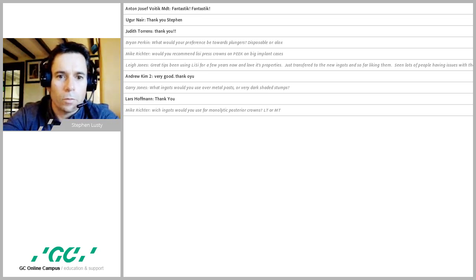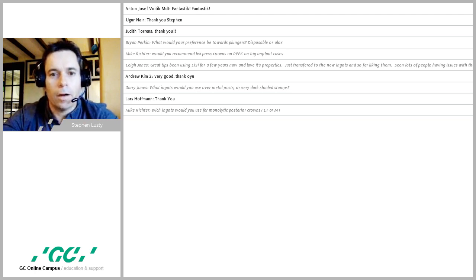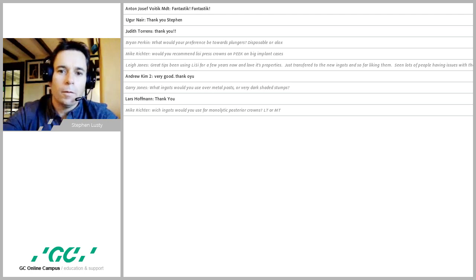So, Brian Perkin asks, what would my preference be towards plungers, disposable or Alox? As I said, Brian, I am using Alox at the moment. I've heard a lot of good things about the disposables, and the recommendation is towards disposables. I suppose when my Alox ones wear out, then I will go on to disposables. But at the moment, I'm finding that if you are really using the separators well with the Alox plungers, you don't have any problems. But I think a lot of people are having cracking of their ingots with the Alox plungers, mostly because they're not using the separators properly. So I don't really have a personal preference at the moment, but in my opinion, you can use both. But the recommendation is definitely disposable from the company.